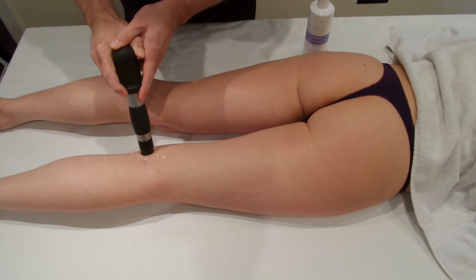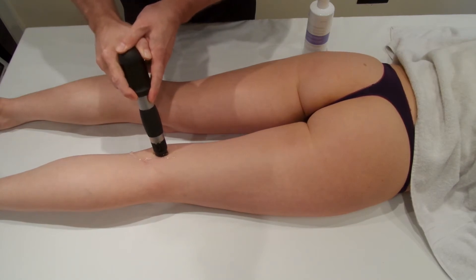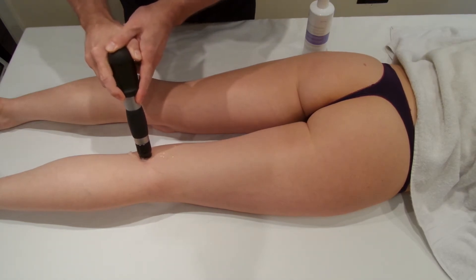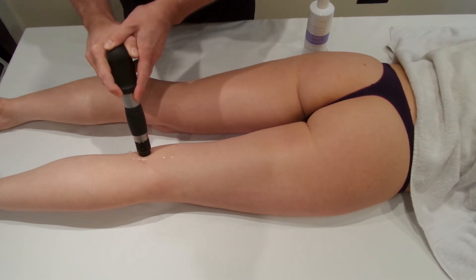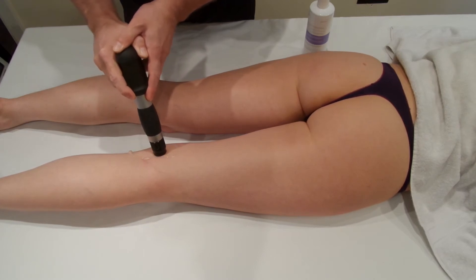It's not unusual to roll off the hamstring tendons as you're doing this treatment. If you do, don't worry about it — just come back on. A little bit of treatment around the hamstring tendons to encourage some infiltration of fibroblasts and other growth factors like IGF 1 and 2 is always useful. So don't worry if you're not exactly on the hamstring tendons — it's perfectly fine, you'll increase healing around them by just going around them.